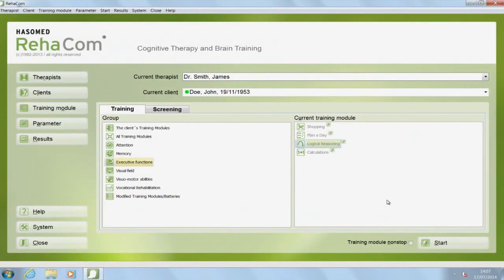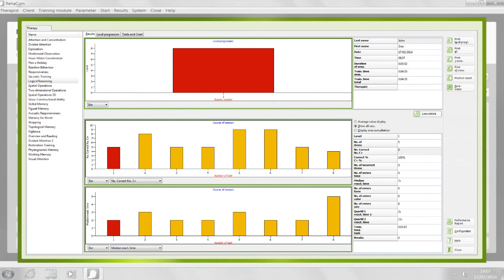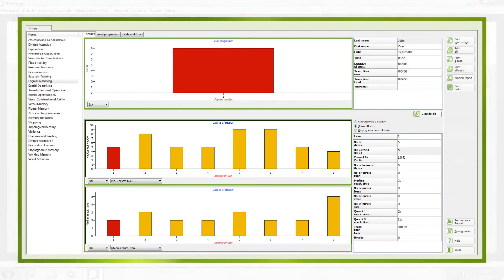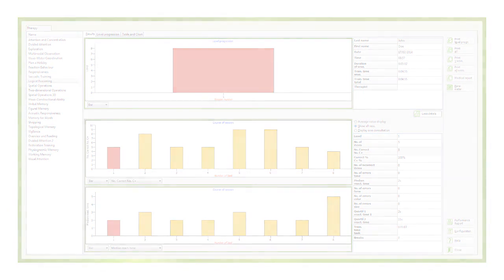At the end of a training session, RehaCom will create an evaluation graph. Training results will always be saved automatically. The patient will then continue from this stage when starting the next training session.